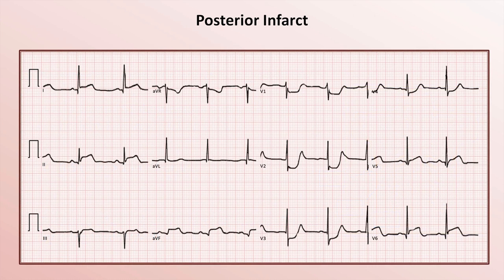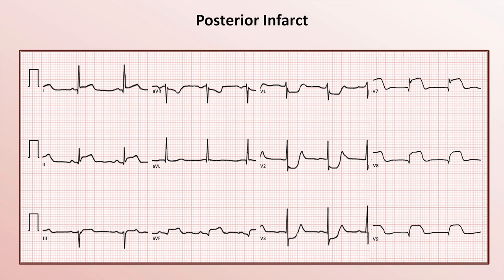Here is an EKG of a patient experiencing an inferior STEMI. You can also note the ST elevations in leads 1, V5, and V6, indicative of a larger inferior lateral STEMI. Inferior lateral STEMIs frequently also involve the posterior wall, which is already suggested by the horizontal ST depressions in V1 and V2. Here V4 through V6 are replaced by V7 through V9, and the very prominent ST elevations seen here are confirmation of posterior wall involvement.